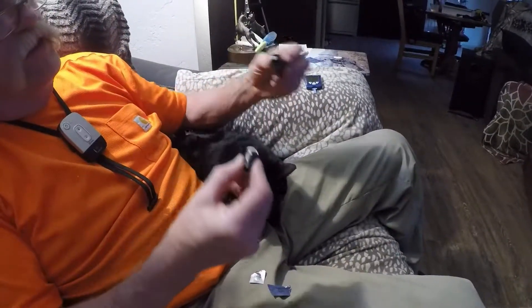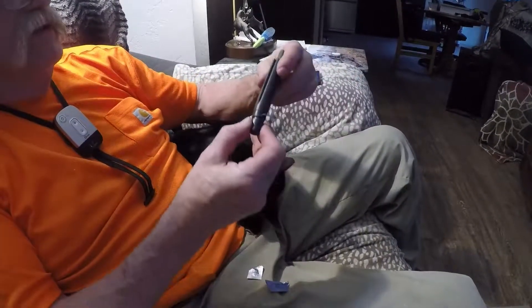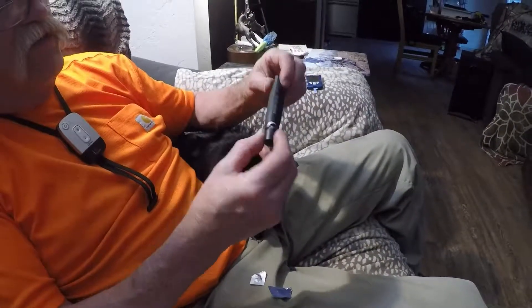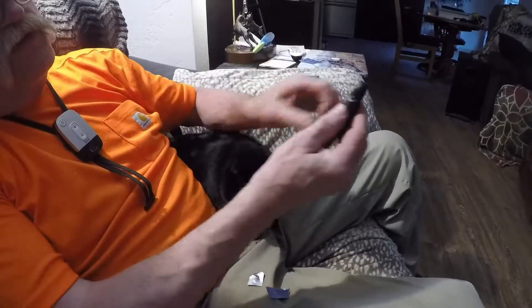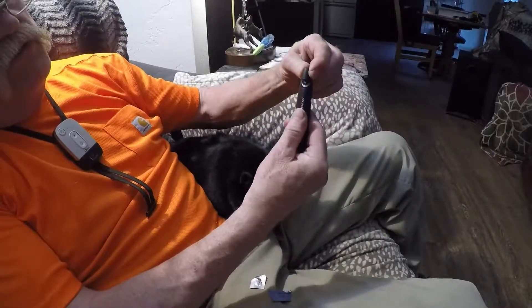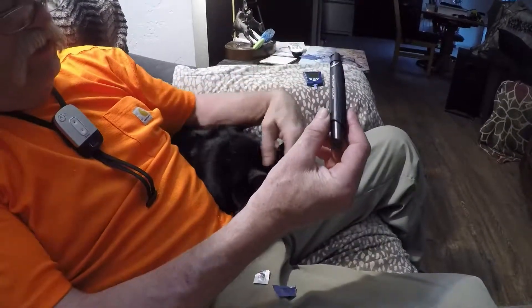This is the lancet that I use. The brand is an Accu-Check Soft-Click. You can set the depth of the puncture — I found that three works best on our cat here.